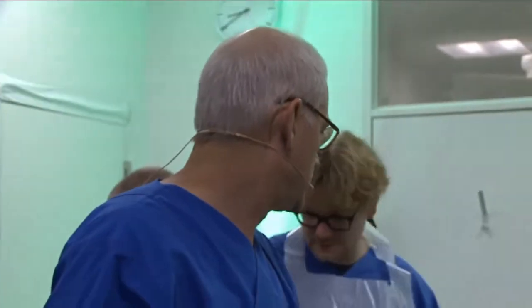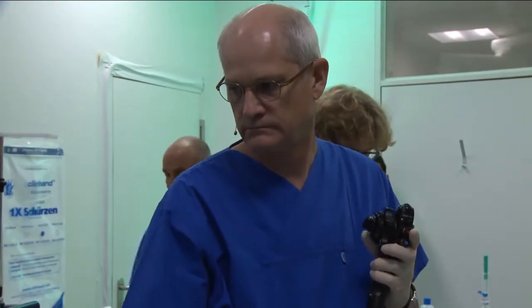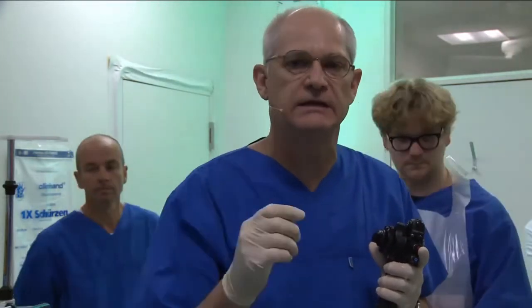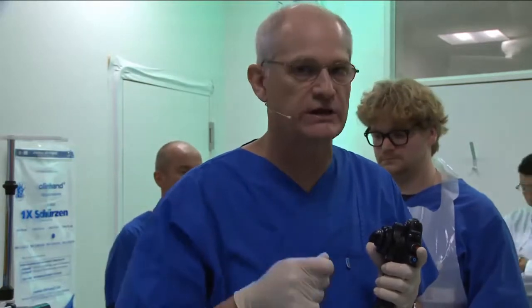We have a question from the audience. Marcin Polkowski: Rob, what is the idea behind removing the stylet slowly during the puncture? Because at the end of the procedure, you anyway apply suction. Right. So I would not have normally applied suction. It was offered, and I went ahead and did it. But the idea of the wicking, I think, is an intermediate step between no suction at all and sucking with a syringe.